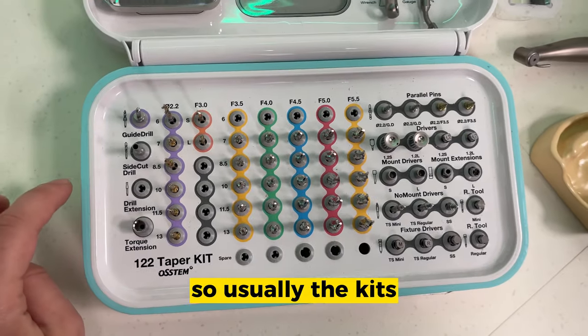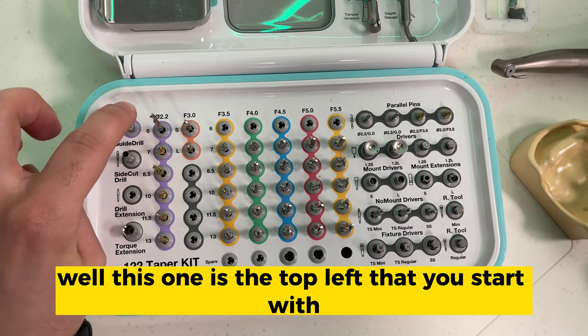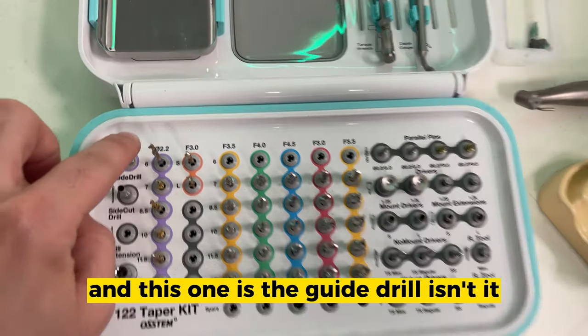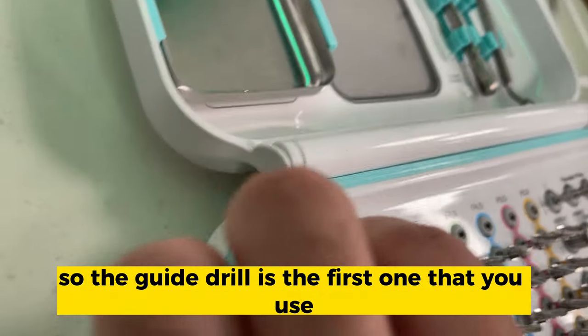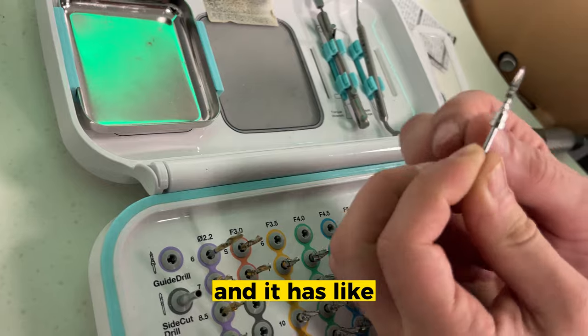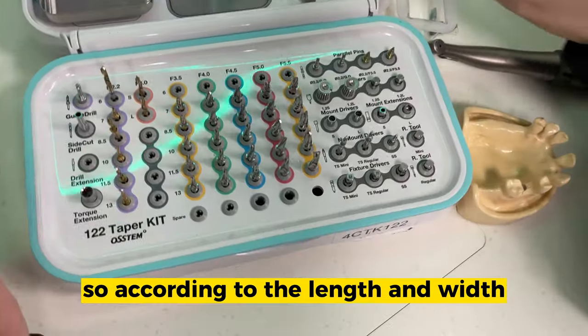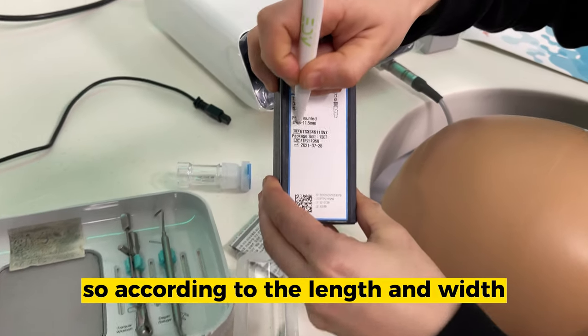So usually the kits apparently start in the top left or bottom left. Well, this one is the top left that you start with, and this one is the guide drill, isn't it? So the guide drill is the first one that you use. There we go. And it has little lines on it. We'll show you the measurements as well, according to the length and width.